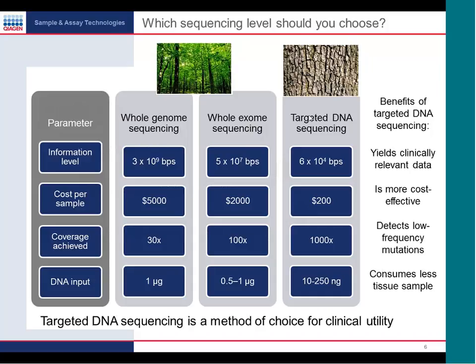And obviously, in the clinical setting, the samples are going to be very precious, and targeted DNA sequencing needs only a very low DNA input, ranging from 10 to 250 nanogram. So taken together, we can say that targeted DNA sequencing is the best choice for clinical utility.